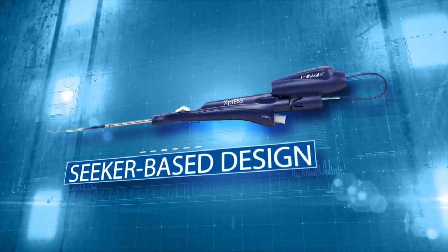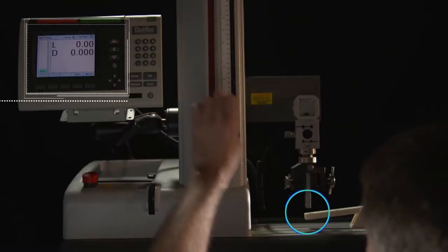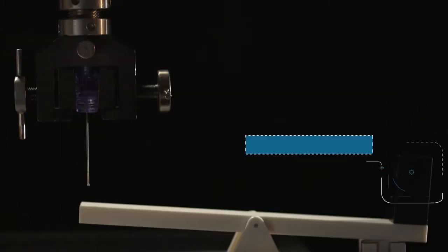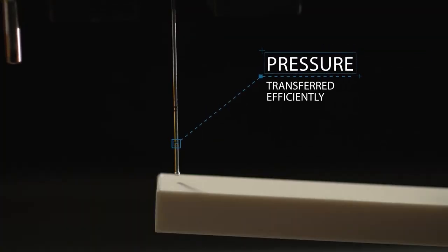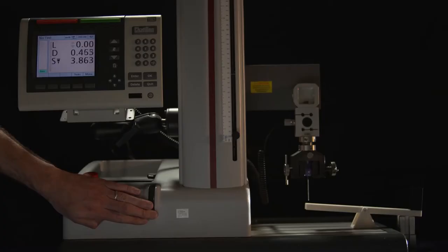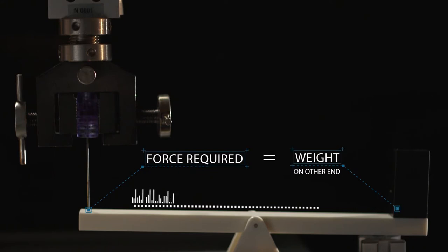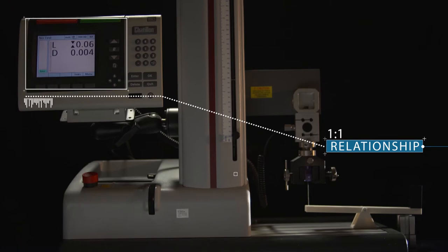But let's see just how well a seeker-based device delivers on tactile feel. We can measure the tactile feel of a device by measuring the force required to level off a teeter-totter with a known force on the opposite end — in this case, a quarter-pound weight. As the seeker-based design pushes on the teeter-totter, it levels off. The force required is approximately the same as the weight on the other end. The stimulus is transferred directly from the handpiece to the tip — this approximate one-to-one relationship is the very definition of tactile feel.